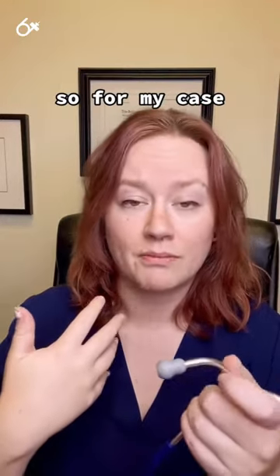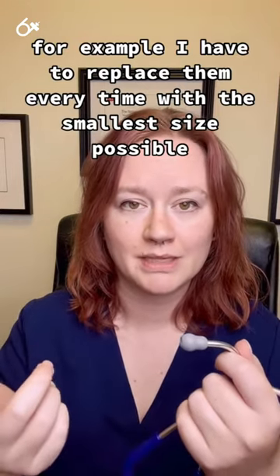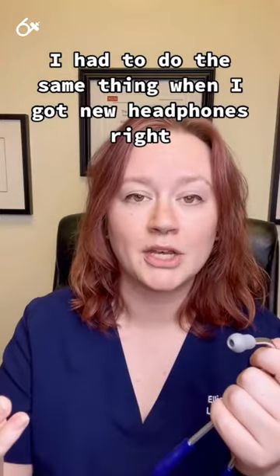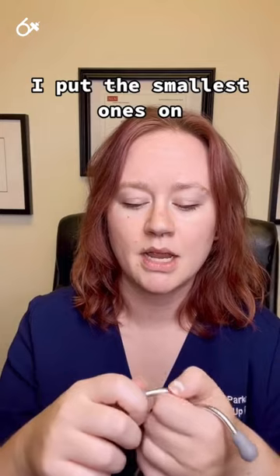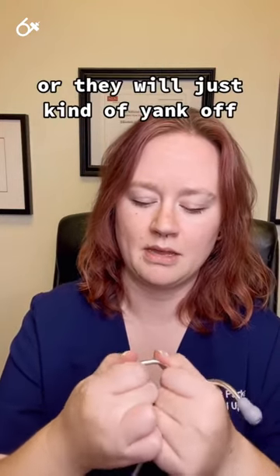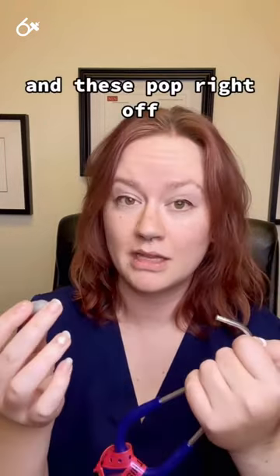For my case, for example, I have to replace them every time with the smallest size possible — it's just what works best for my head. I had to do the same thing when I got new headphones; it came with different earpiece sizes and I put the smallest ones on. With a stethoscope, they will twist depending on the brand you have, or they will just kind of yank off and pop right off.